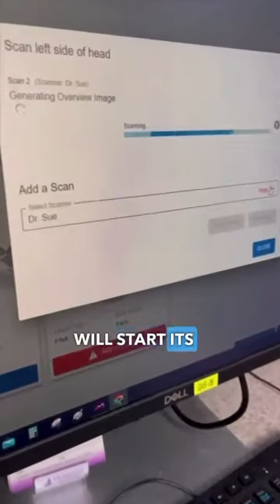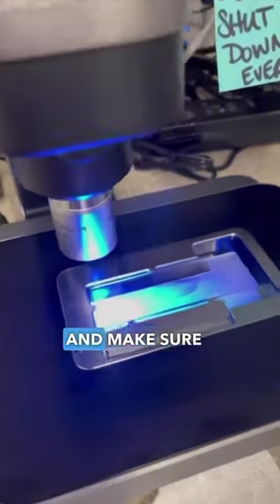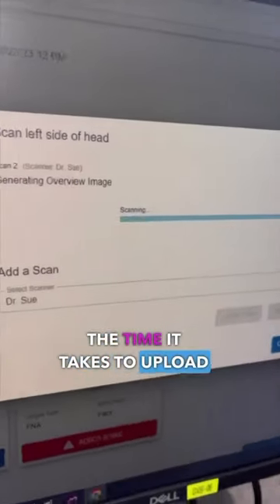The scanner will start its scanning. Before we do the submission, we're going to preview it and make sure the scan area is focused down. By focusing down, we decrease the time it takes to upload.